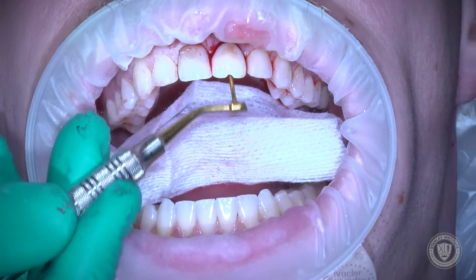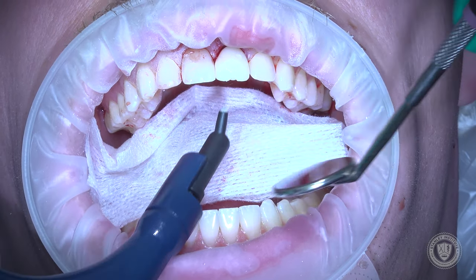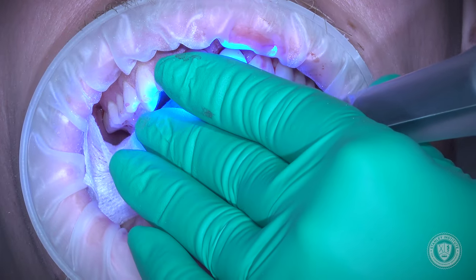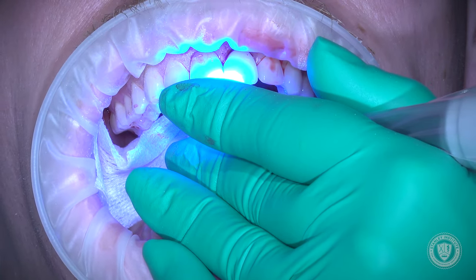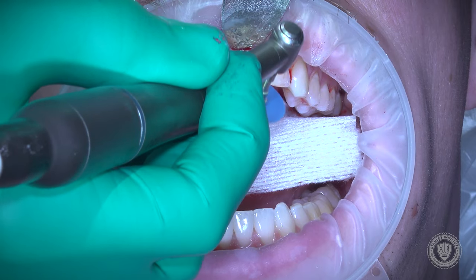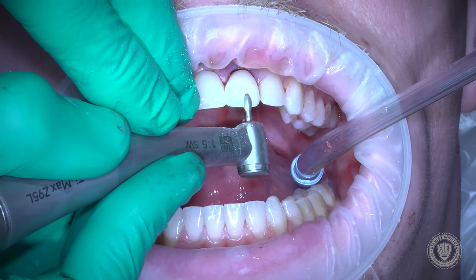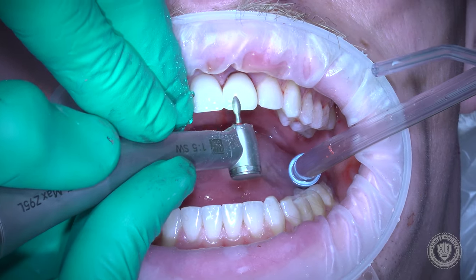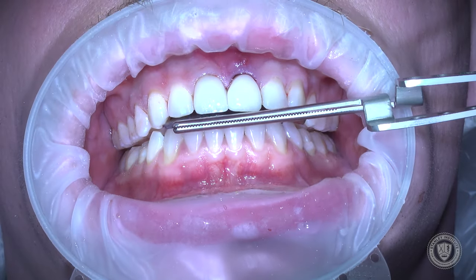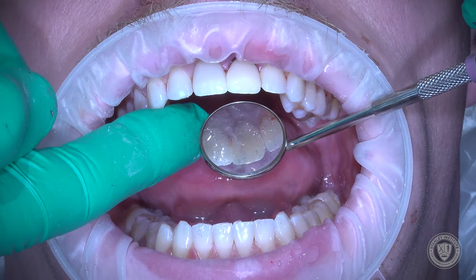We've tightened it, and we're placing PTFE in the access hole with a little composite to finish the case. Then we check occlusion and make sure this is a non-functional provisional — the patient is not allowed to eat with this temporary tooth. Checking occlusion and refining the composite access on the facial, making sure it looks good. This whole procedure took about 12 to 13 minutes in real time. You can see why we don't want to do any elevation of the soft tissue — we want to keep that soft tissue intact.